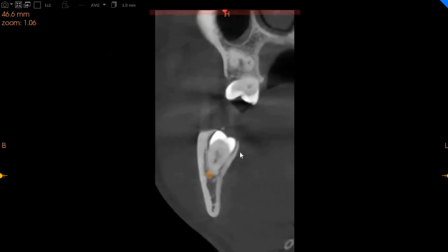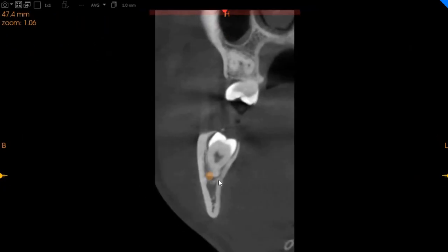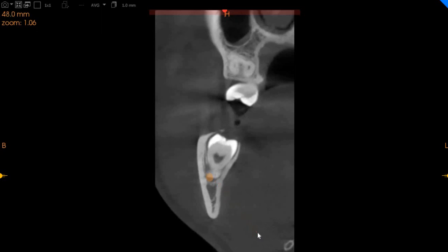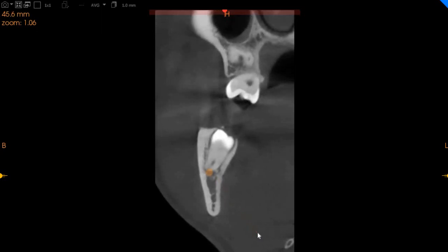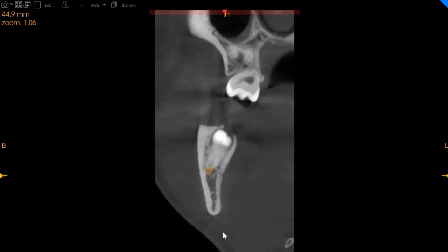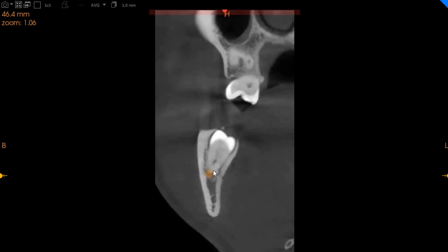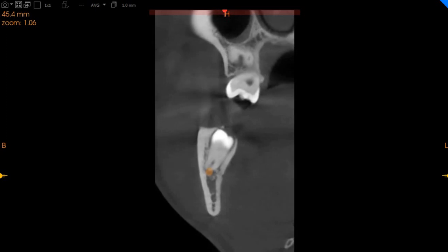This is the transaxial view, and here you can see there is extreme compression of the inferior alveolar nerve by the lower right wisdom tooth. Both roots curve around the inferior alveolar nerve. There is a very high chance of nerve damage when we talk about the lower right wisdom tooth.